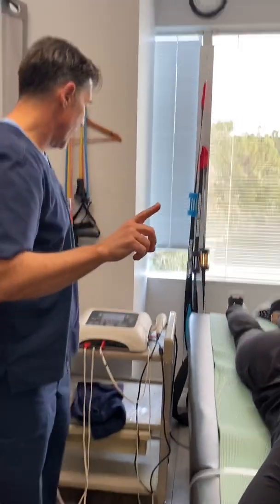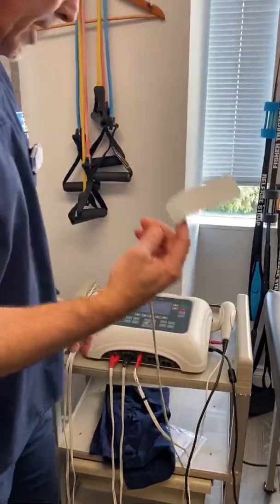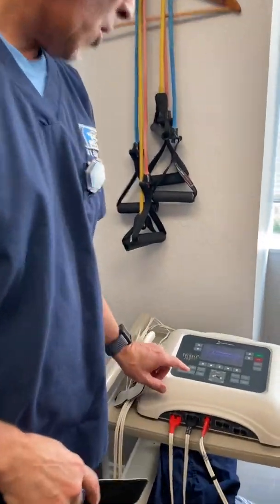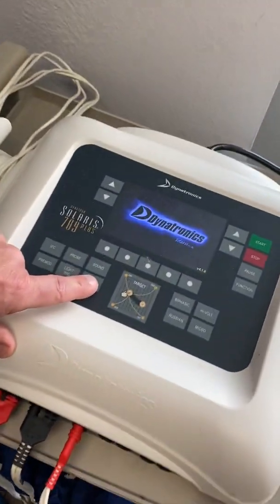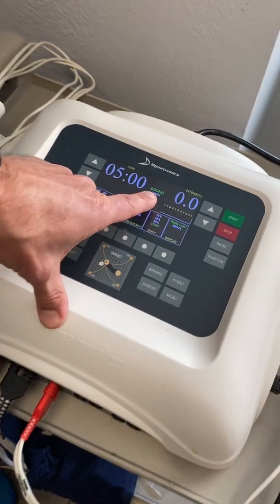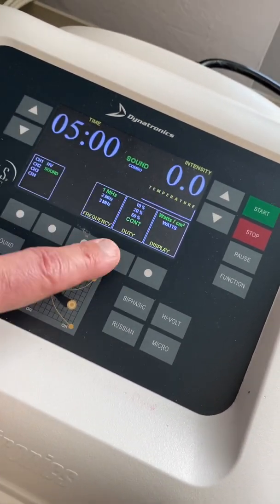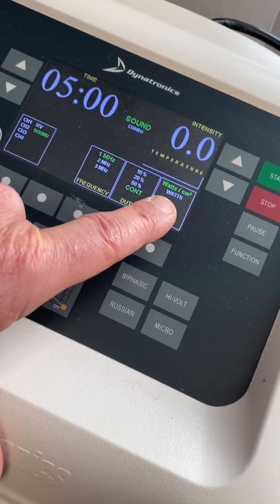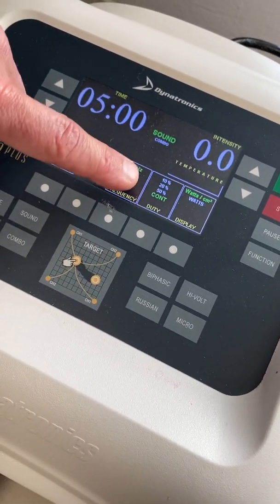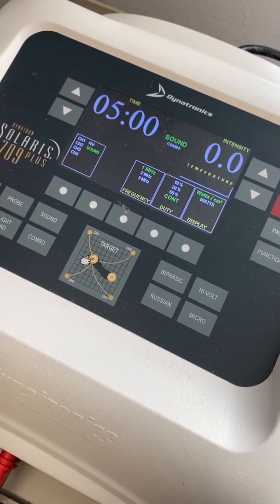Okay. Cool. So now how we do this is this machine, great machine. Again, here's the full panel of Dynatronics. What we do is we go right to combo. And the first thing that pops up is the ultrasound. You can see there's a temperature, there's intensity, watts per centimeter squared or watts. There's continuous, there's 50%, 20%, 10%, 1 megahertz, 2 megahertz, 3 megahertz, okay?